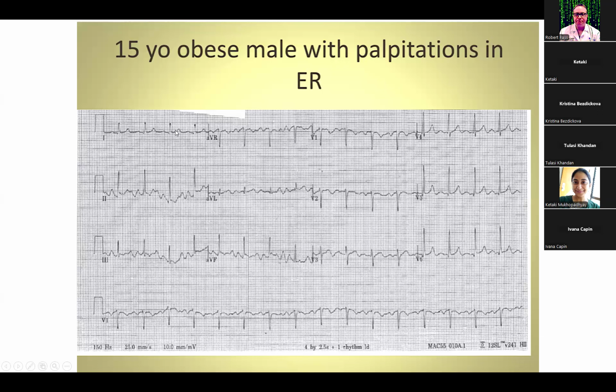This is one of the advantages of a 12 lead, which is why I'm always saying that whenever someone's asking you to assess a rhythm, the very best test you could get, if you have a choice, is a 12 lead rather than an A-wire or other things, because it allows you to look at the rhythm in different directions and in different vectors.